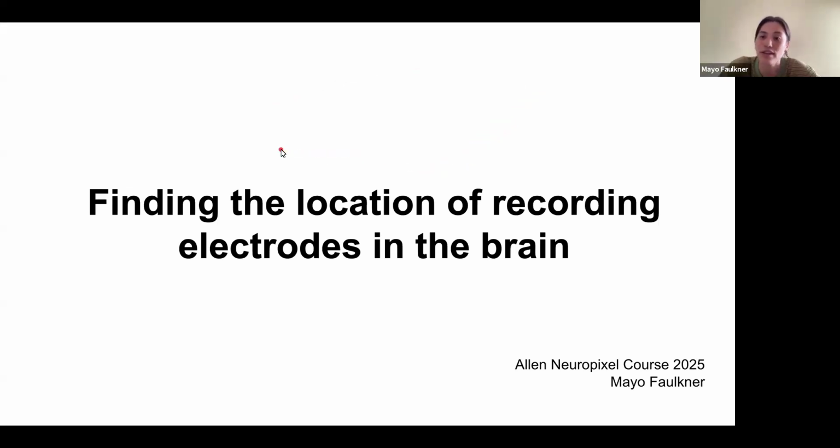So yeah, my name is Mayo Faulkner, and I'm a research software engineer at the International Brain Lab. And today I'm going to talk to you about how you can find the location of your recording electrodes in the brain.